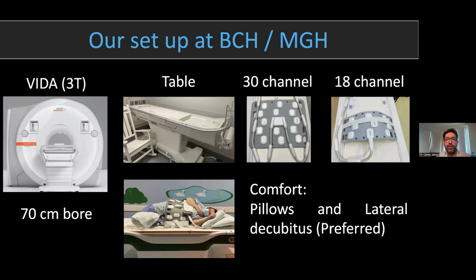I favor the 30-channel abdominal coil on two fronts. More elements are advantageous in general in terms of SNR, but the second part is you don't always know where the baby is located. So it is totally acceptable to place the coil where you think the baby is located or where you think your highest yield area is. However, you may have to relocate and course correct.